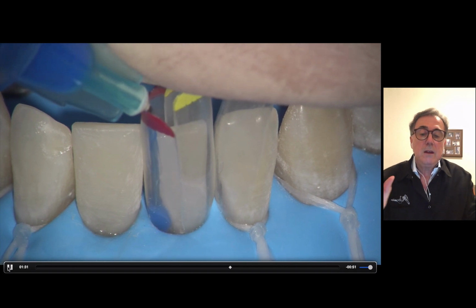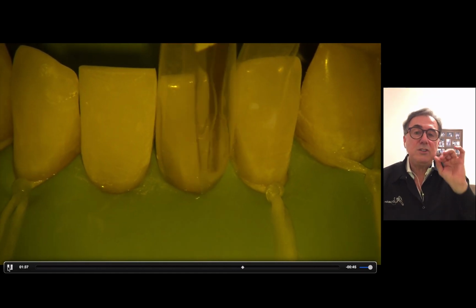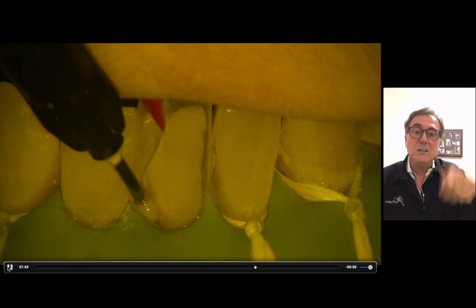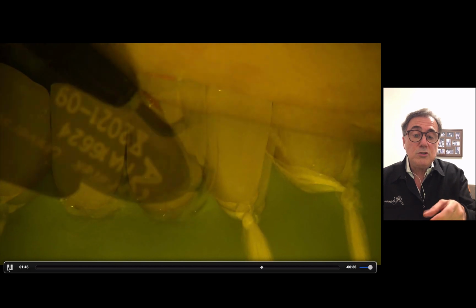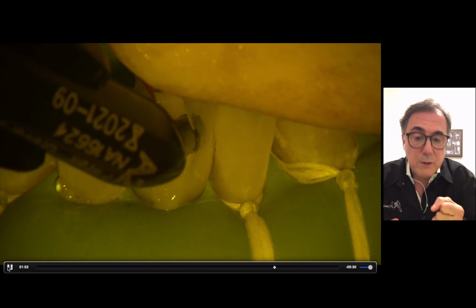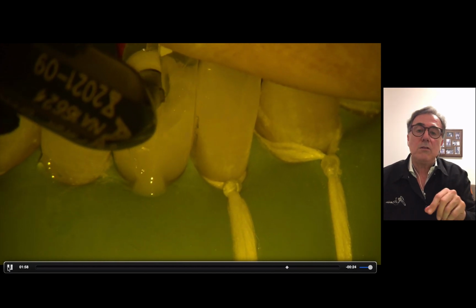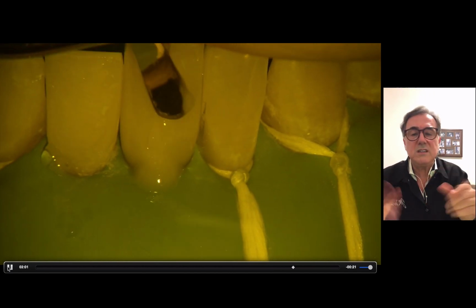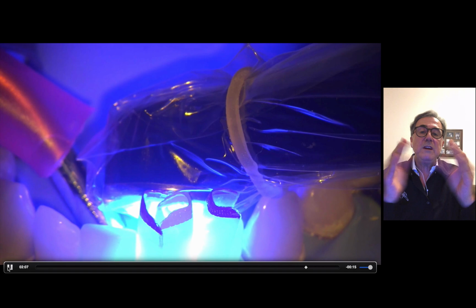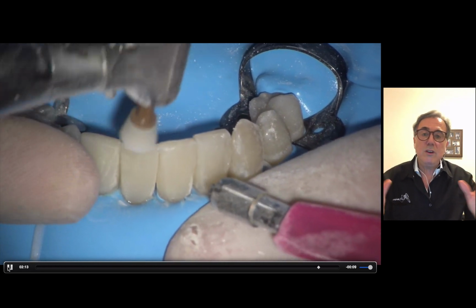So we're going to do the acid etching, rinse it thoroughly, and then we're going to scrub your adhesive very hard for at least 20 seconds. Then you're going to inject the flowable composite, and then you're going to inject the restorative composite, both of them heated, between 60 and 70 degrees centigrade. After that you just make sure that your matrices are in place and the composite is well distributed inside that aquarium, and then you do the other two teeth after you finish that.